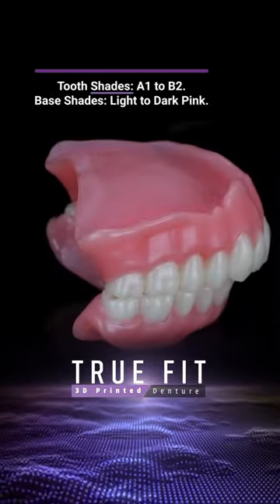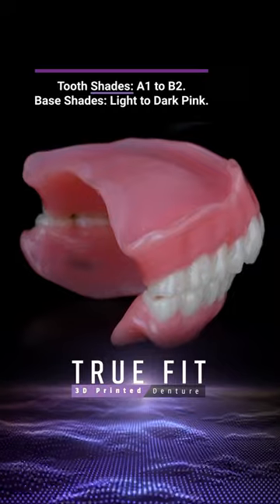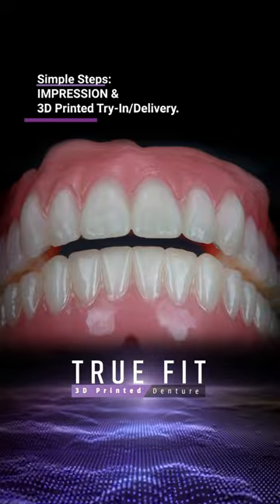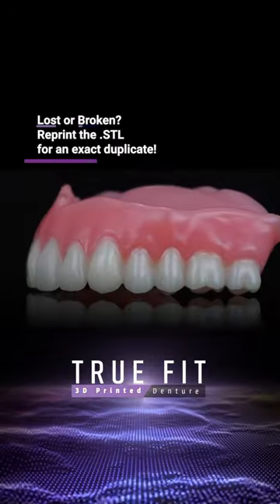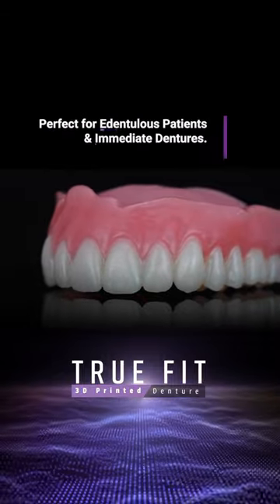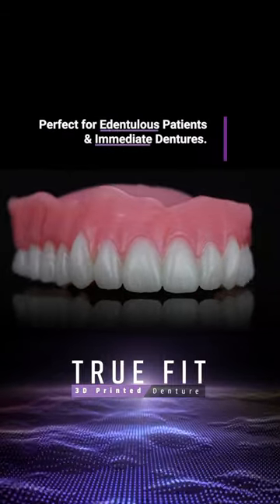With a spectrum of natural tooth and base shades, efficiency is at the forefront. A thorough impression leads to a 3D printed try-in or the final product delivery. And with the promise of swift replacements from the original STL file, TruFit streamlines your practice and patient experiences.